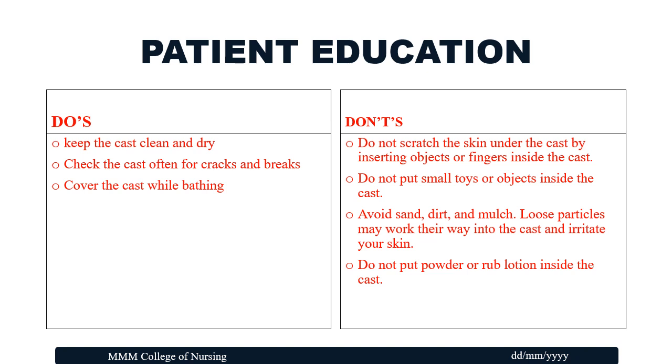Okay. How do you educate a patient? We had seen the definition, the application, the different types of casts and the articles required. Now moving on to the education. After application, for 6 to 8 weeks, during that period you have to educate a patient.